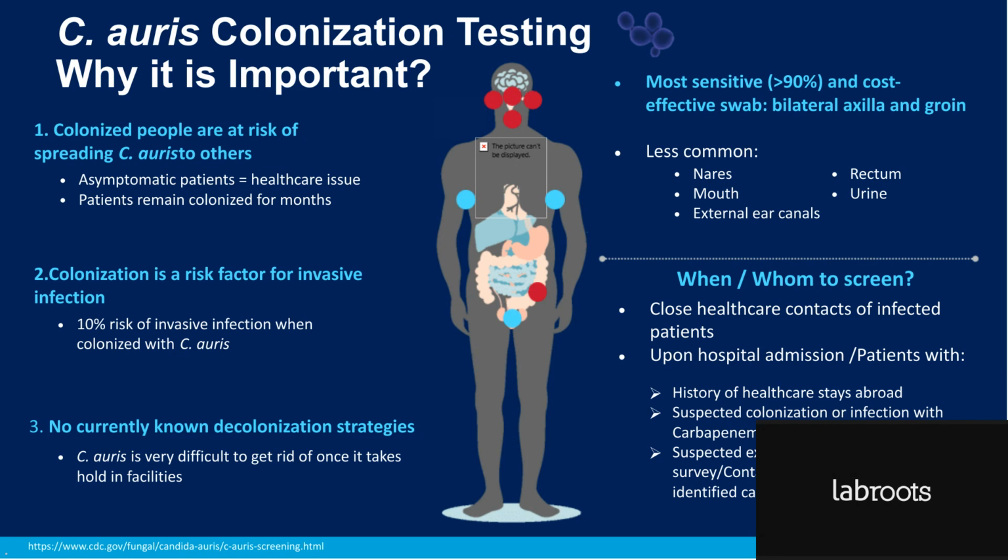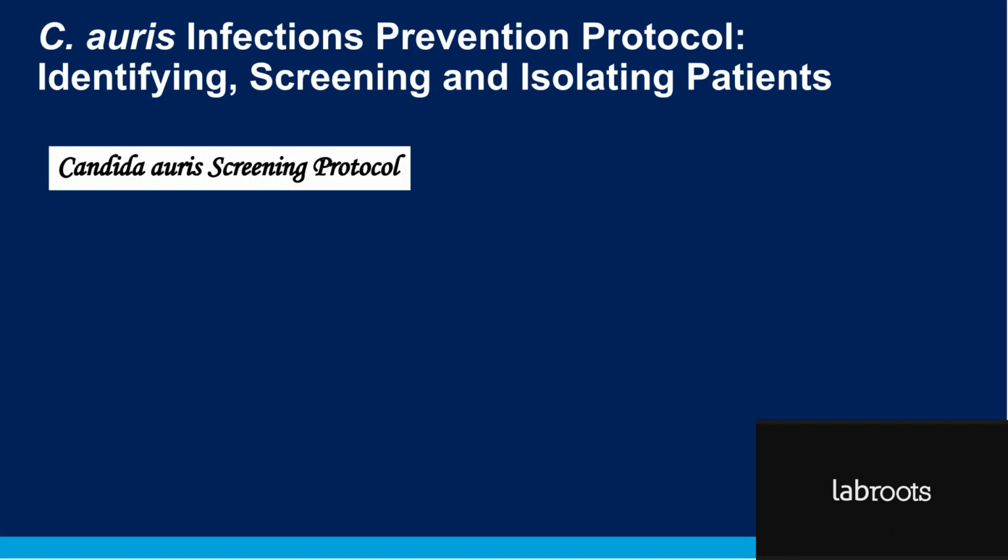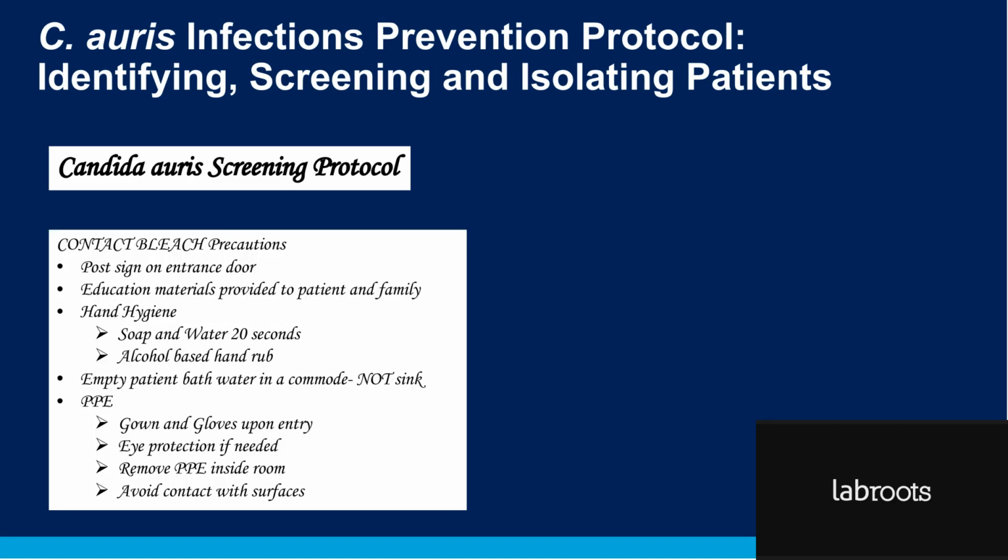So based on these recommendations, we started our own screening algorithm, and infection prevention here at BayCare was kind enough to share their algorithm with us, as we've been very close collaborators in this, as in many other projects. So Candida auris, of course, is subject to contact bleach precaution if somebody is infected. And so there are many signs and many things that need to be taken into consideration when treating these patients.